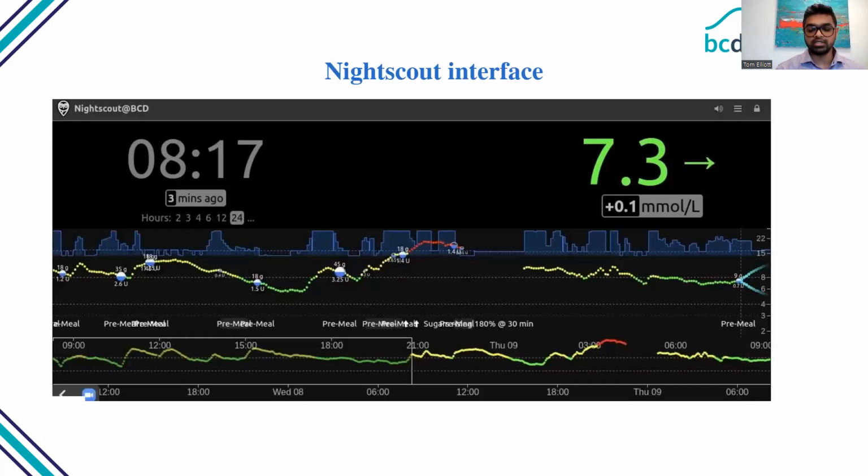We use a remote CGM monitoring anonymized URL called Night Scout to track our patients' numbers, compile reports, interpret their data, and make configuration adjustments. Every patient was provided a unique Night Scout account by BC Diabetes at no charge.